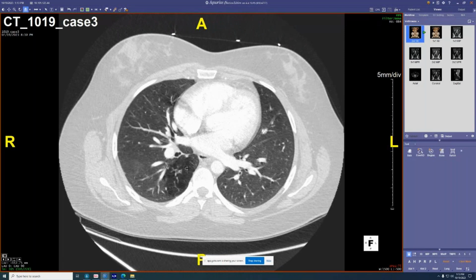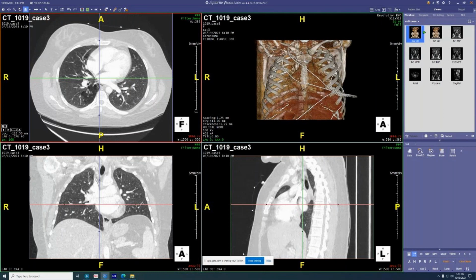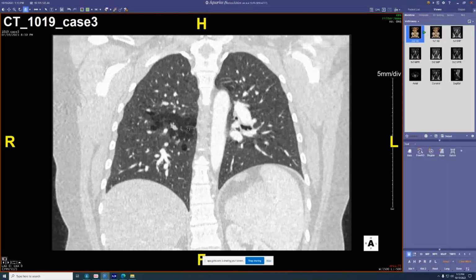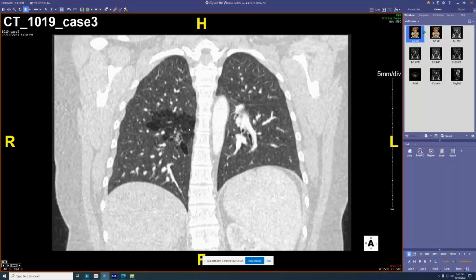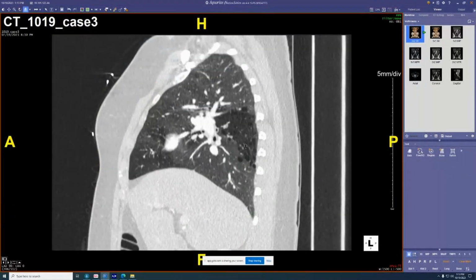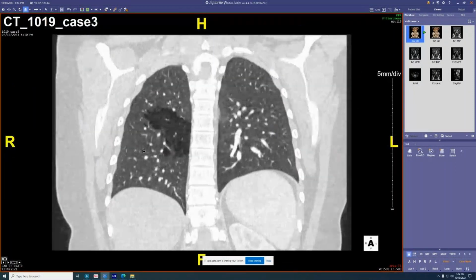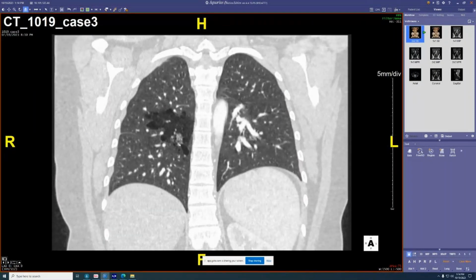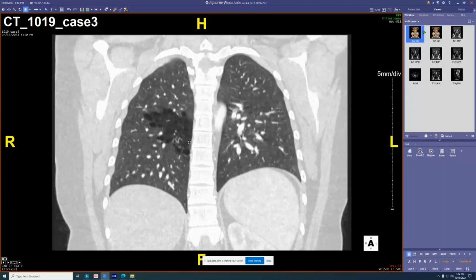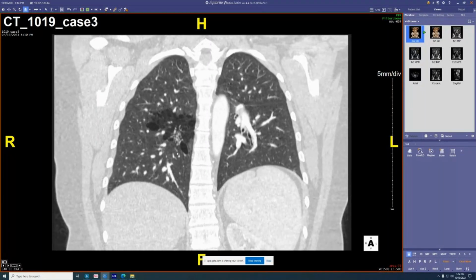The only thing I was wondering about, I was reading about this, and technically, not that we're pathology, the cysts are smaller than 2 centimeters. So I guess this would technically be a type 2. But there's this bubbly nodularish ground glass thing in the CPAM, and I know there's an increased risk of adenocarcinoma, but I just said to follow it up. Would any of you think anything with this?